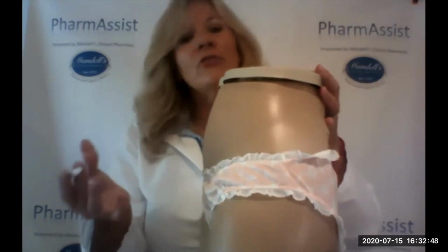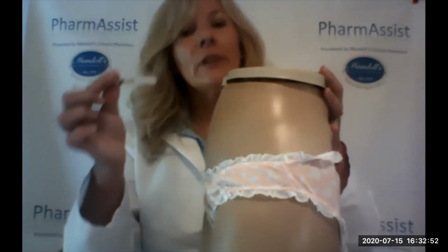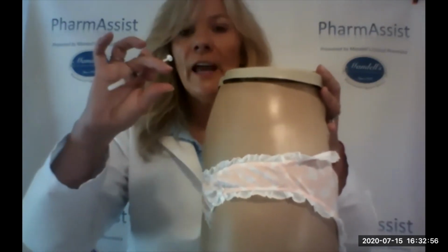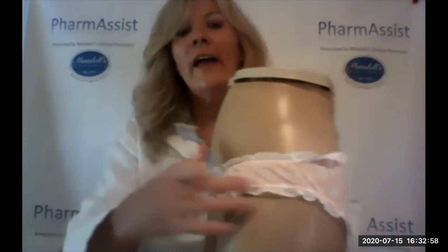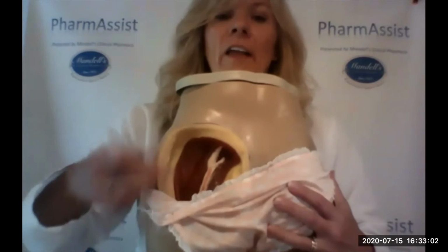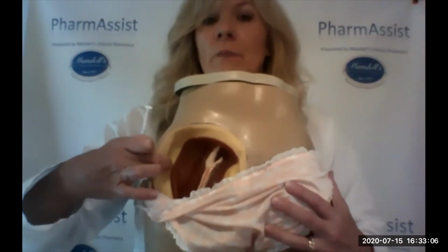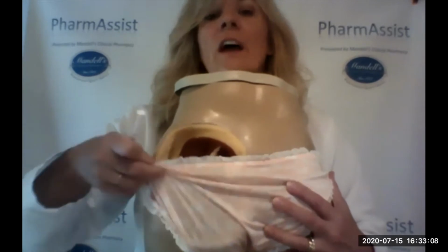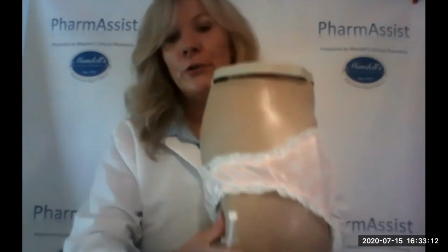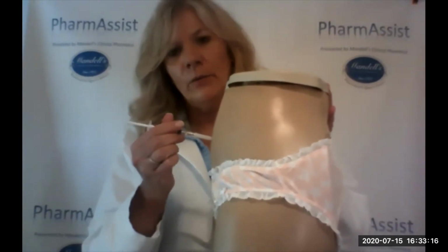And a big question I always get asked with the shots is, does all the needle go in? And you really do need to make sure with this one that all the needle goes in, because you're really only putting in a 1/2-inch needle. And as you can see, I'll just show you on this mannequin, we all have this yellow area, which is fatty tissue, and it's usually more than a 1/2 inch. So that's why we're picking these areas that have good fatty tissue for you to use, but it's very important to get it all the way into that area, okay?